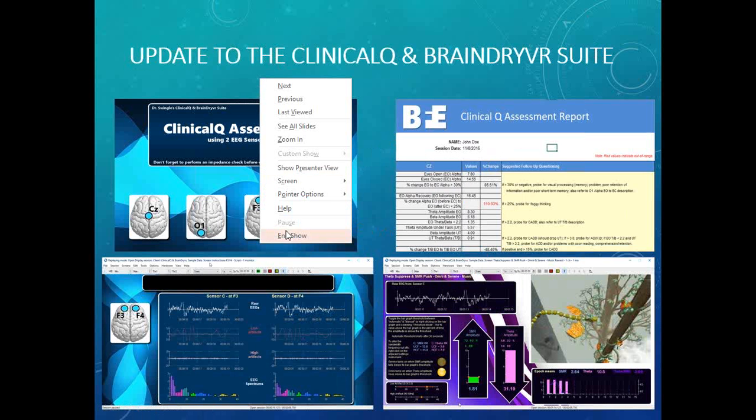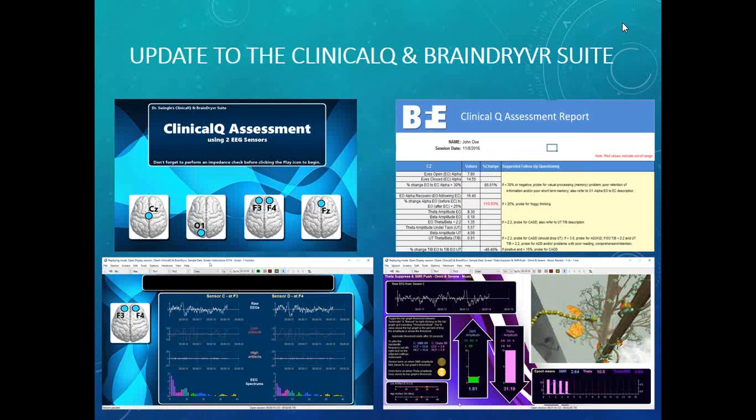Because that's pretty much the gist of the website. I'm really excited that we finally have this launched. We've had it out since the ISNR conference back at the end of September, I think. September, October? No, it must be September. Time flies. And we've had plenty of people try it out and use it, and they're all extremely excited and happy with it so far. So we've had some great feedback. I'm super excited.